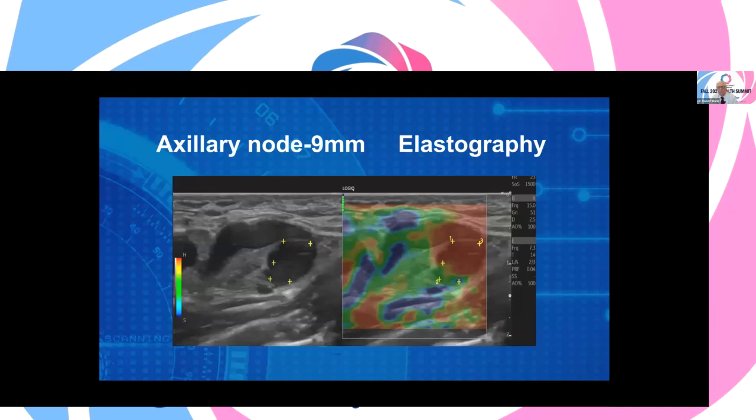This is one of the main uses of elastography, which was started in America, actually in Chicago, half a century ago, by the laboratory that invented the atom bomb in Chicago. So the physicists there were looking at sound waves too and said, see, what can you do with this? Well, as you measure the speed of sound, guess what? When tissue is fibrotic or cancerous, it blocks the speed of sound. That's why you see the sonic shadow. This is a way of quantifying the sonic shadow because we are using it to see cancer tissue.